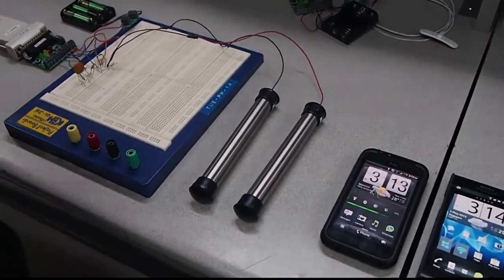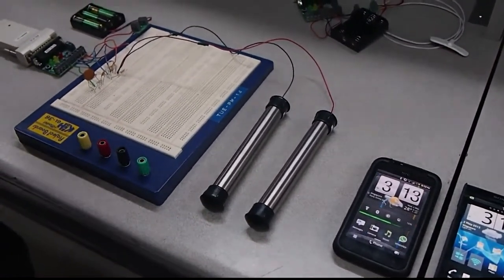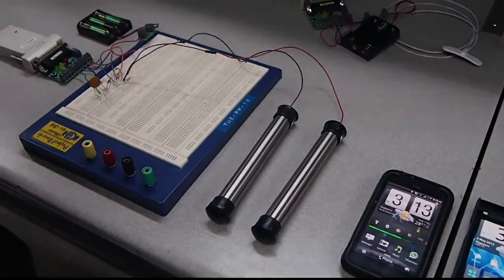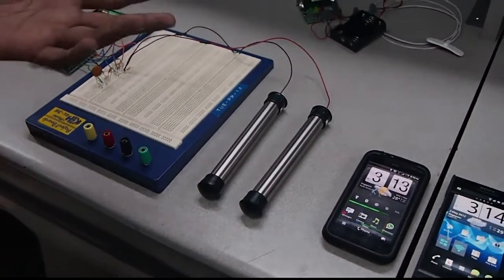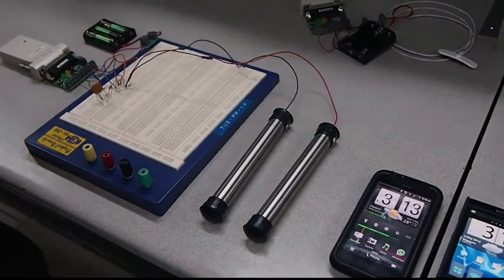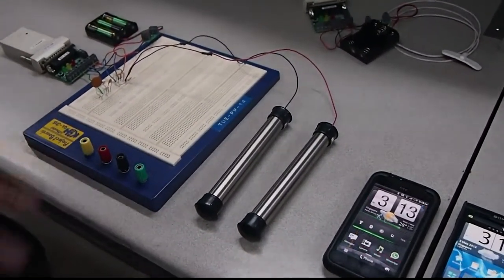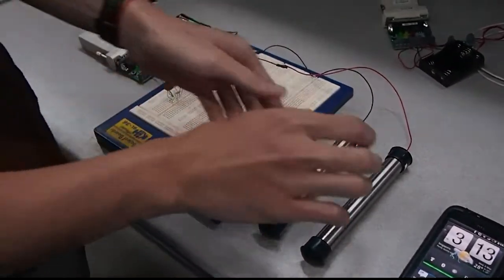Okay, good afternoon. I'm going to continue from the project as just now. I'm going to start on the ECG part, so maybe I can ask my friend to hold on to the electrodes to measure his heart rate.